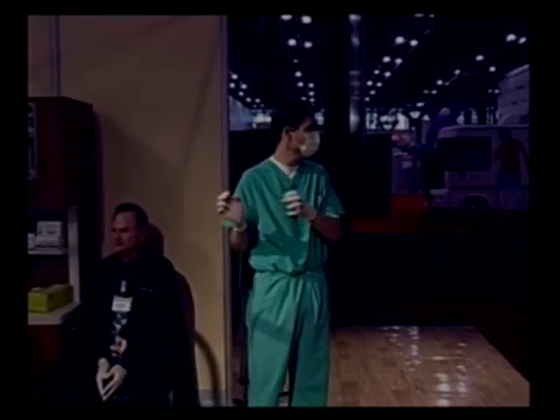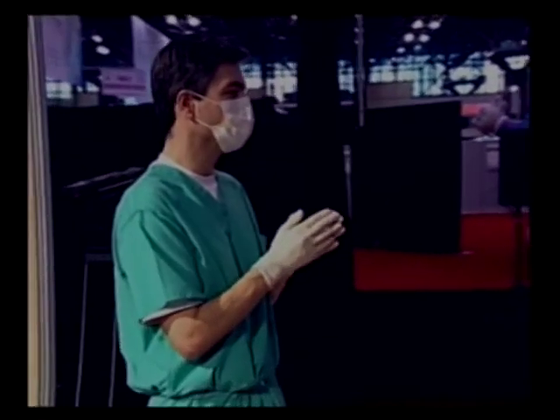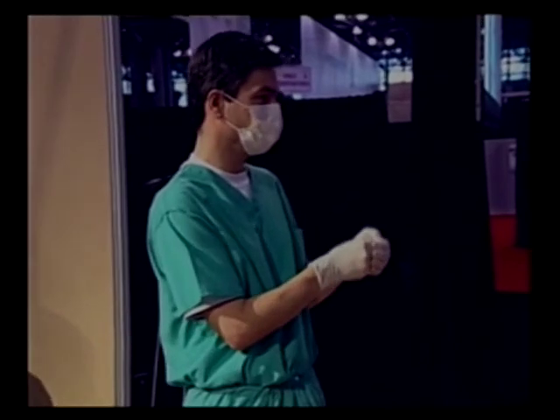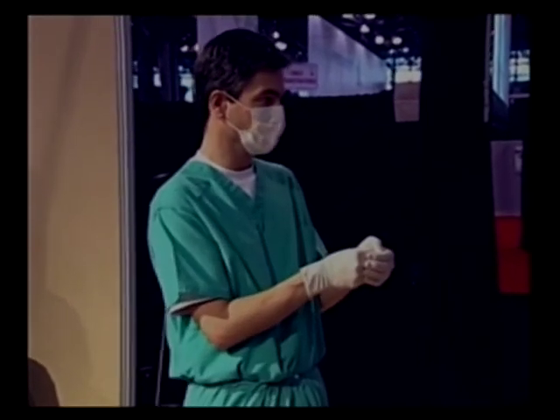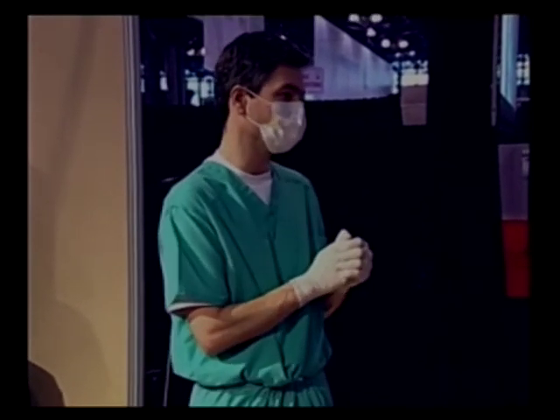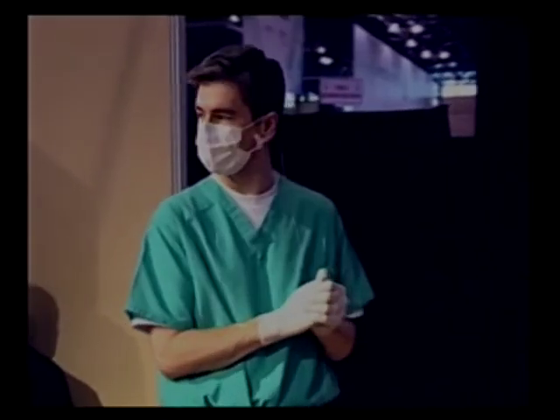Yes, we can take the x-ray at this point. I think it starts to show how very precise that can be. The patient experience is very easy. You can literally — and I think Dan will speak to this later — have someone in the office scan them, plan, and within the hour do the surgery. It's just a wonderfully powerful system.